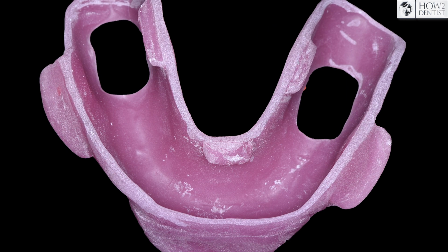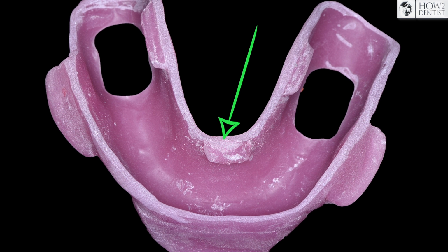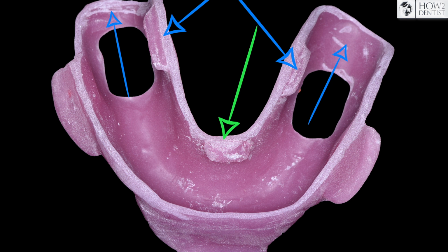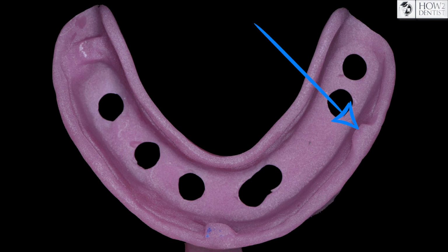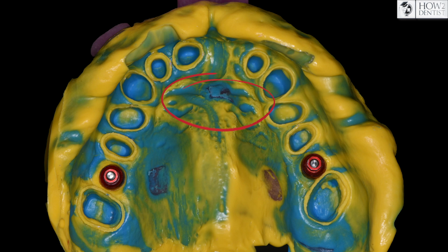The lower jaw stoppers should be located frontally, on the lingual surface at the same time, either on the mucous membrane or on the teeth. Distal stoppers are retromolar, or lingual or vestibular, depending on the anatomy and the specifics of the case. We see no need to place the stoppers on the teeth, although this is possible. So with total work, the stoppers will be on the mucous membrane, and in other situations it makes no sense to change the scheme.